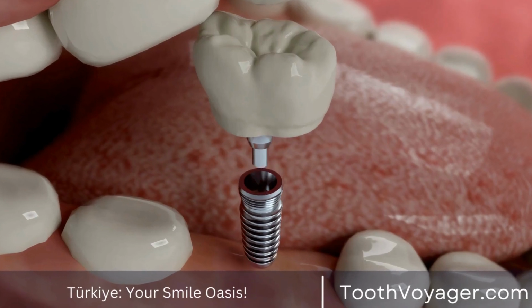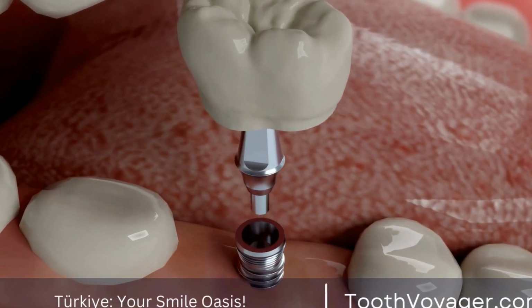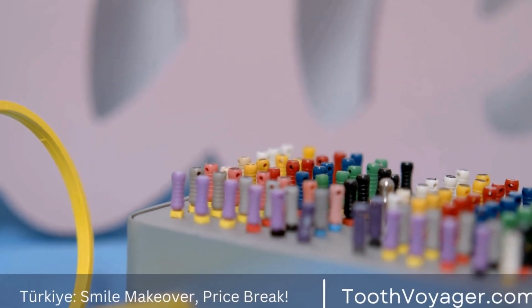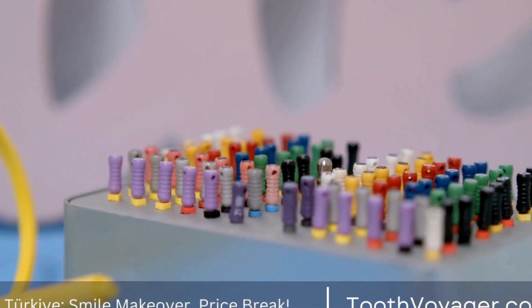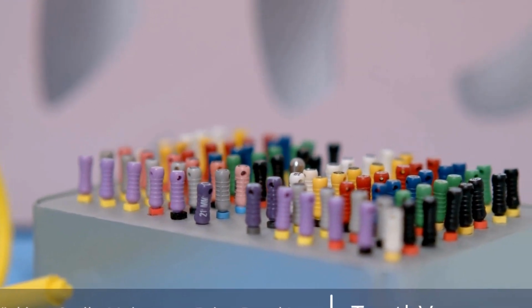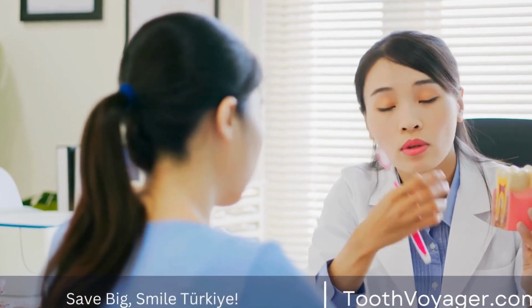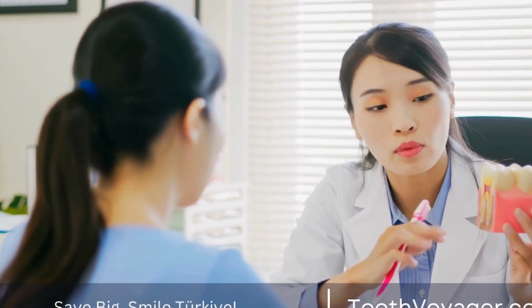The process of dental bonding is a standard method used to repair and strengthen teeth. It's an effective treatment that is able to repair a wide range of dental concerns, like broken, chipped, stained, and distorted teeth. In this clip, we'll look at the technique of dental bonding, what it involves, the process, and the benefits that come with this procedure.